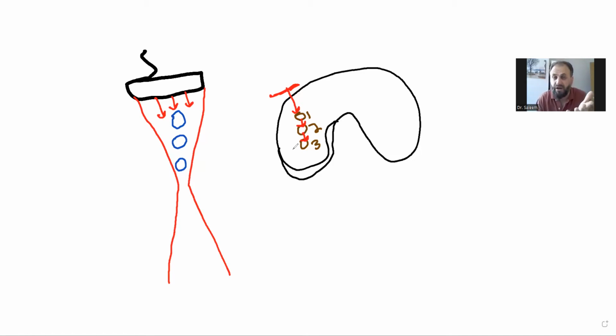How many there are? So, axial resolution is very important, not only to know the detail of them, to give us the information regarding these three masses or these three nodules or structures, but also to give us the correct number of them too. So axial resolution is important for them.